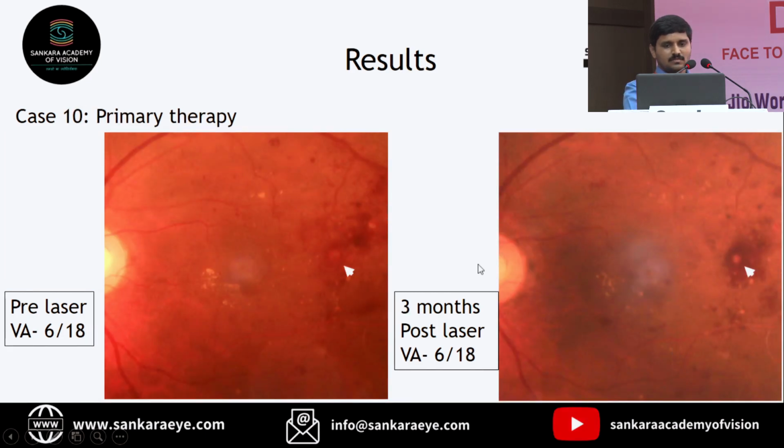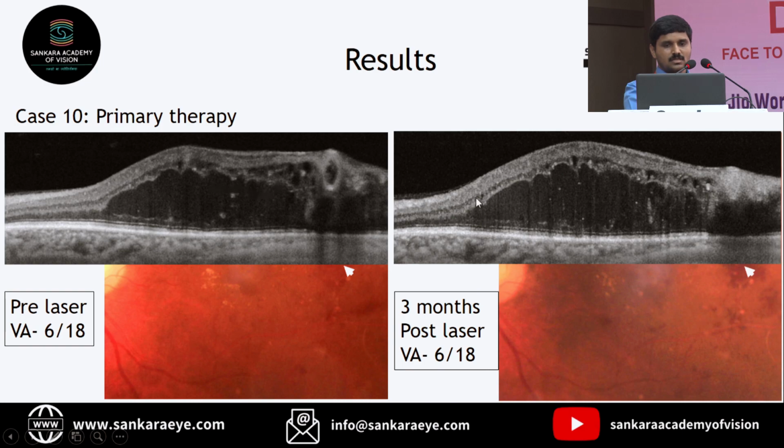Case number 10, here we can see that there is an aneurysm over here with a surrounding intraretinal hemorrhage. Post laser, the hemorrhage actually increased, but there was no change in the macular edema. Rather, there was a minimal increase by 3 months of follow-up.